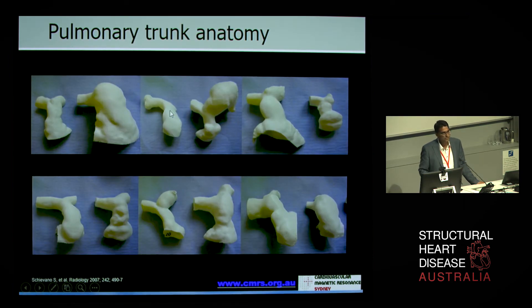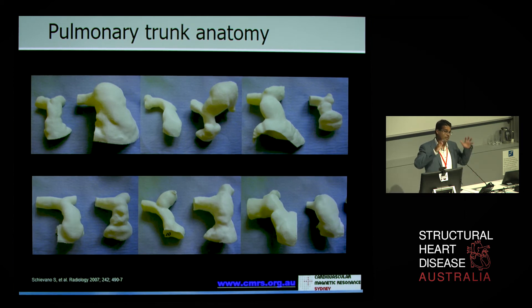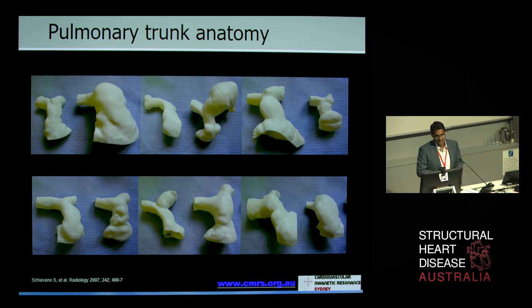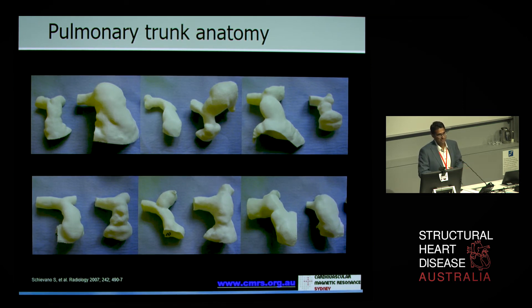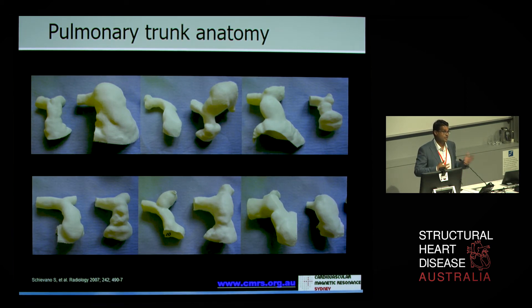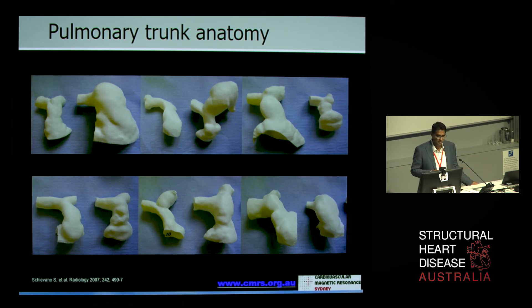These are models of right ventricular to pulmonary artery connections of patients with Tetralogy of Fallot, made by Sylvia Schievano, an engineer I work with at Great Ormond Street Hospital. They really highlight the heterogeneity that exists in Tetralogy of Fallot — the RV to PA connections are really, really different. The ability to tailor treatment for these patients and understand their anatomy and physiology is really important, and MRI really helps with that.